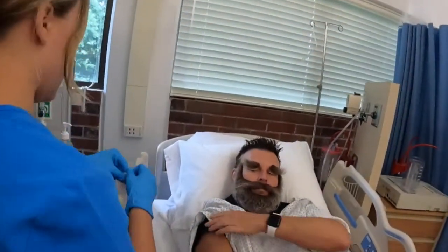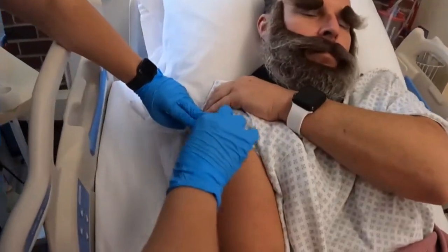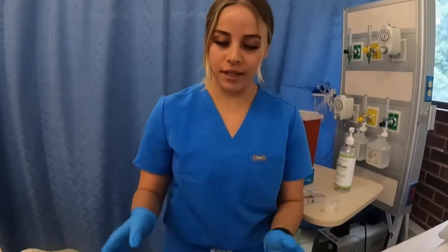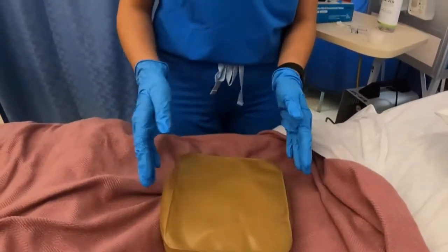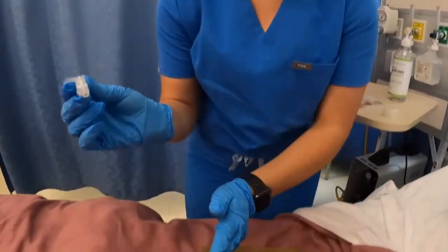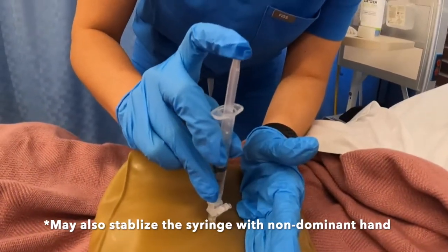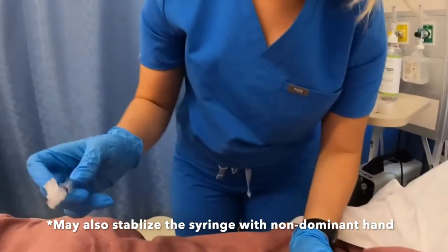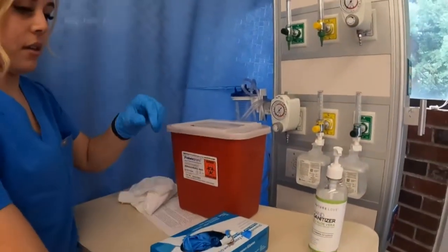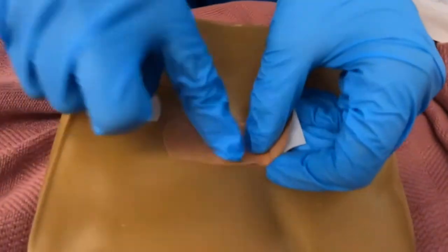I want to clean the injection site — 2 fingers below, and we wipe from the inside out. I've raised the bed and put the railing down. This injection pad will replace the patient so I can demonstrate. I uncap the needle, apply the Z-track method, and in a darting motion inject the patient with morphine. Pull it out, activate the safety, put it in the sharps container, and then apply a band-aid if there's bleeding.